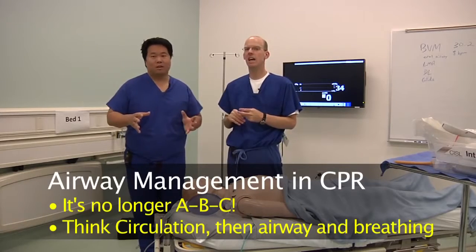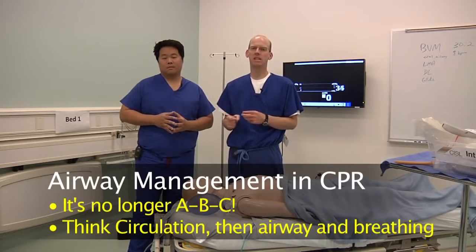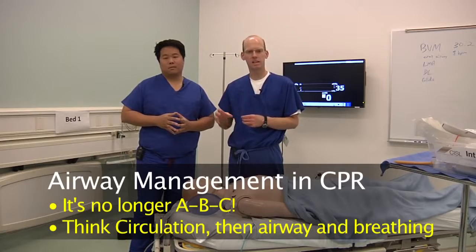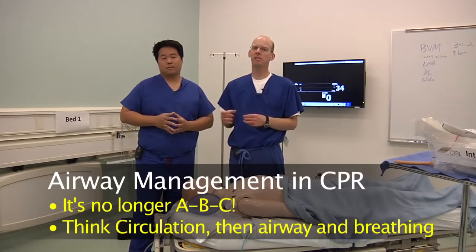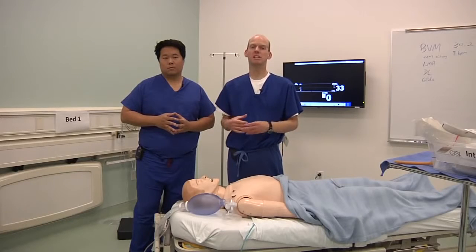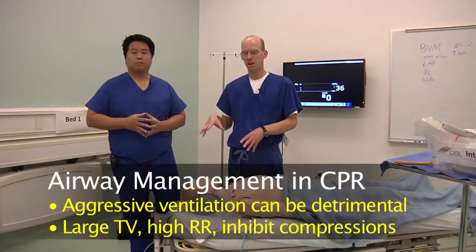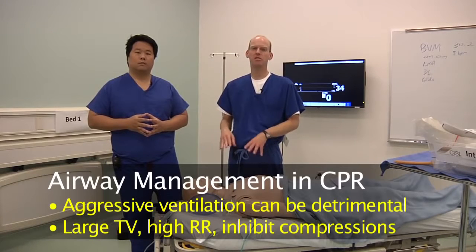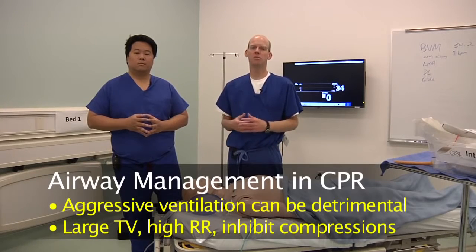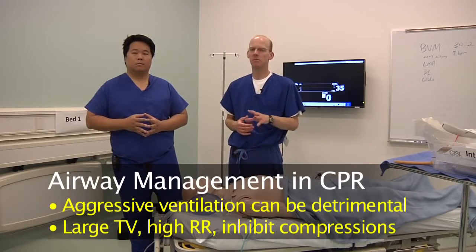It has changed. And you're often able to get at least marginal ventilation, which is all you really need, is to get a little oxygen in. You're not going to try and really ventilate these patients aggressively. We already went over that. Aggressive ventilation is actually detrimental. Large tidal volumes, long inspiratory holds, high respiratory rates, all cause negative performance with your compressions. So less is more.